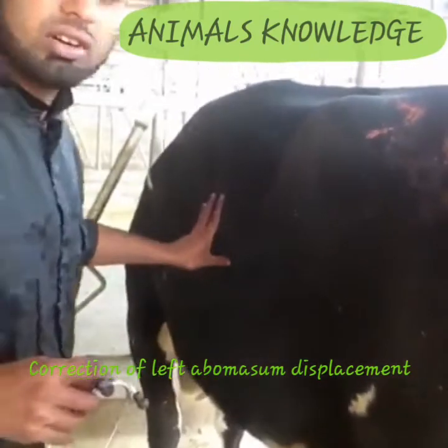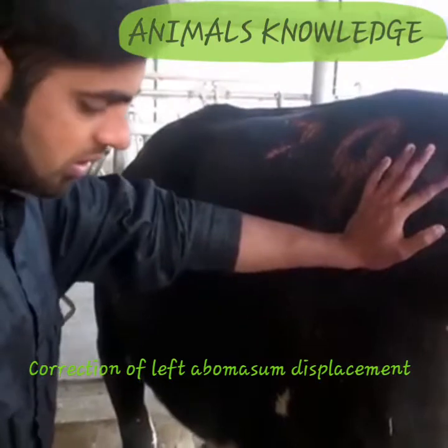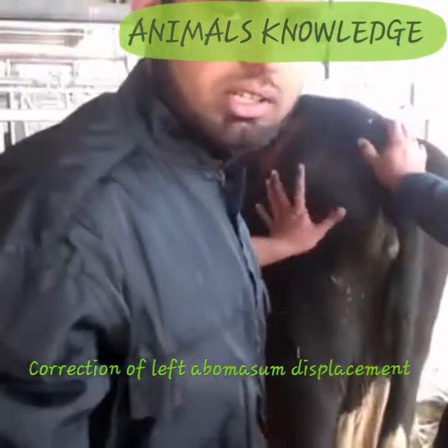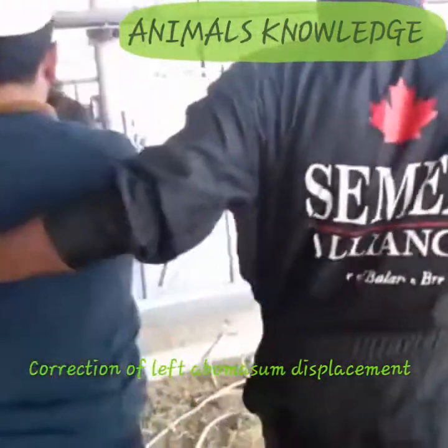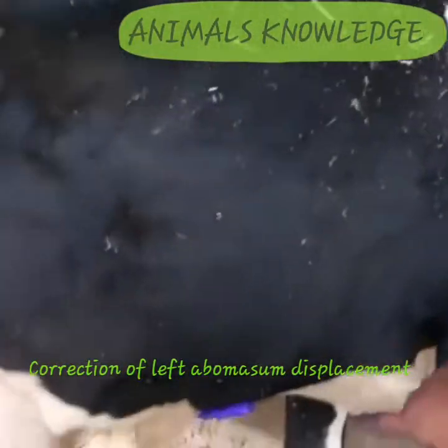You will not hear the ping sounds on the left side anymore, so this is the indication that we have done our toggle roll procedure successfully. You can see the toggle here — we have applied the suture here on the right side.